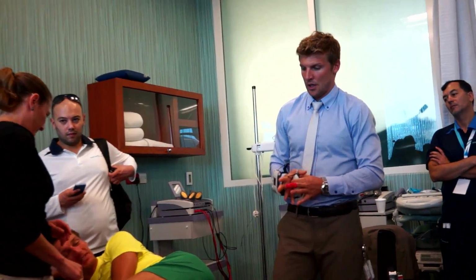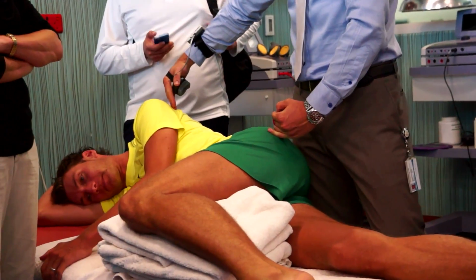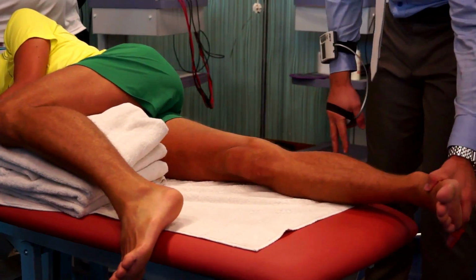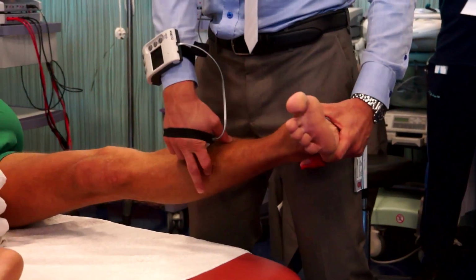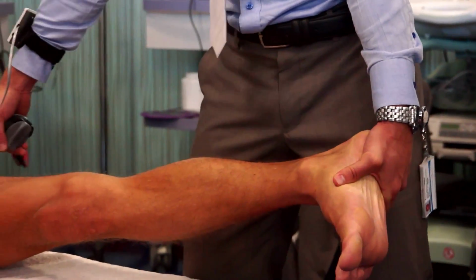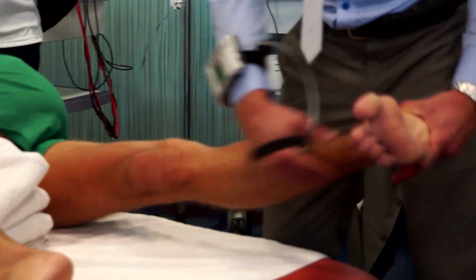Here we're using a bunch of towels to stabilize the pelvis, so he has that in a straight position. Still the same straight position as before. Important again that the knee is straight all the time during the testing, and that will also affect the foot position. So the foot position here is also very important, maybe a little bit up so he doesn't turn, because a lot of the times the players would turn the toes downwards, so they'll use the hamstrings and bend their knees. This was a very common cheating. So really important to keep the knee straight and the foot horizontal.